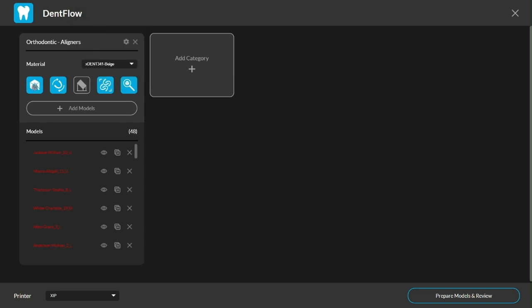You can see below a group of quick toggles for each operation you're able to perform on your imported models. There's the ability to repair corrupted models that are all shown in red underneath. Next, you'll be able to auto-orient to what's best for the desired application. You can generate supports if needed.